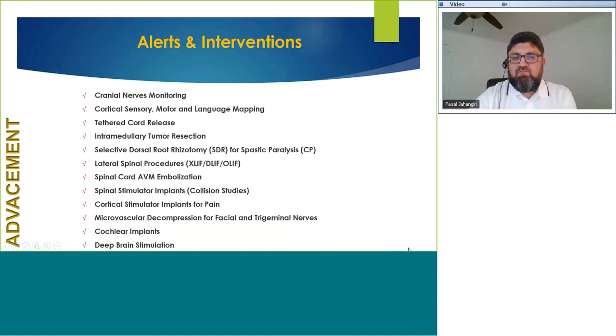So that was just an overview. There are different tests: what surgical neurophysiology is, the history of development of the evoked potential, and different types of modalities: sensory evoked potential, motor evoked potential, EMG, auditory evoked potential. I did not talk about visual evoked potential, but there is also visual evoked potential, EMG, and all the tests. Now, all those are the tests we typically use in the OR.